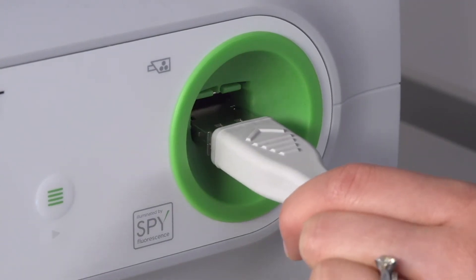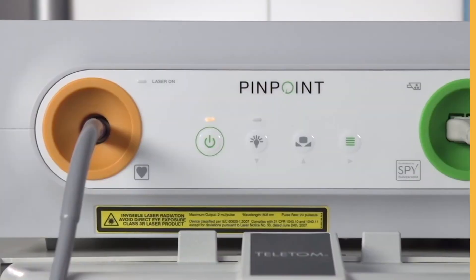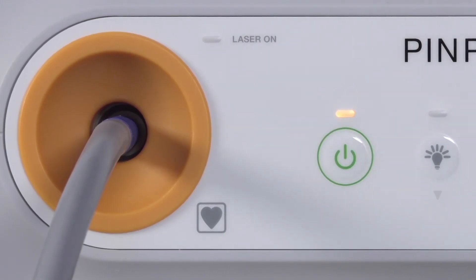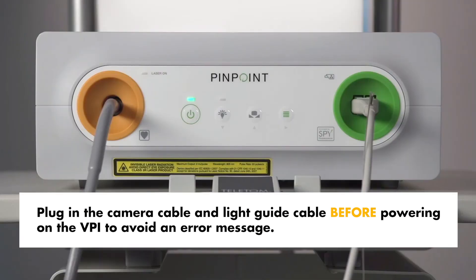Connect the light guide cable by inserting it into the light guide cable port. After ensuring the SpyFi camera cable and light guide cable have been properly plugged in, press the power button on the VPI. The power indicator light will turn green and the system will enter into standby mode. Make sure to plug in the camera cable and the light guide cable before powering on the VPI to avoid an error message.